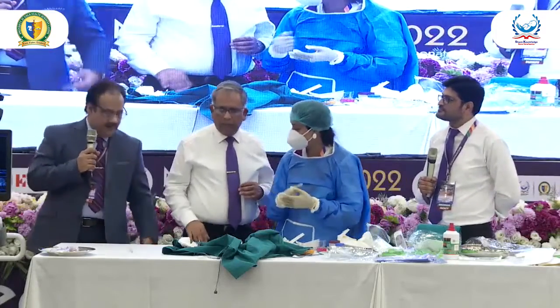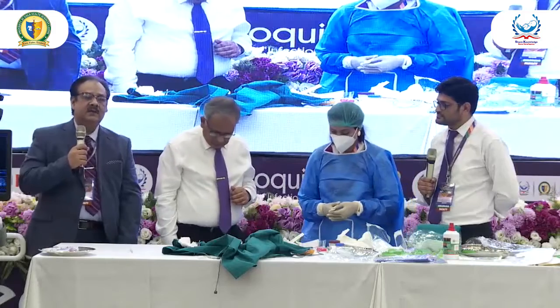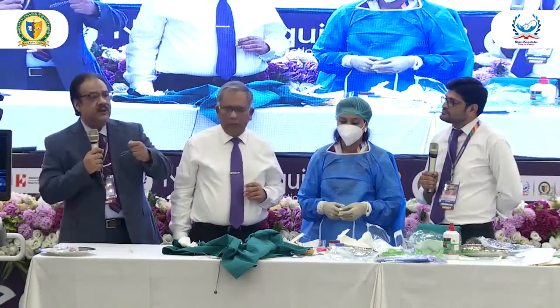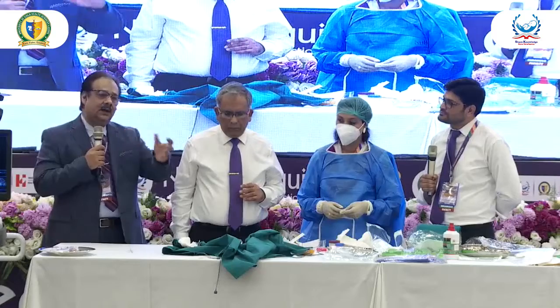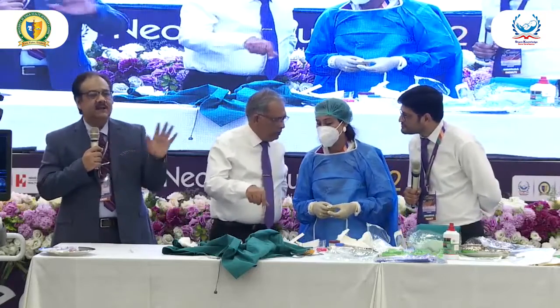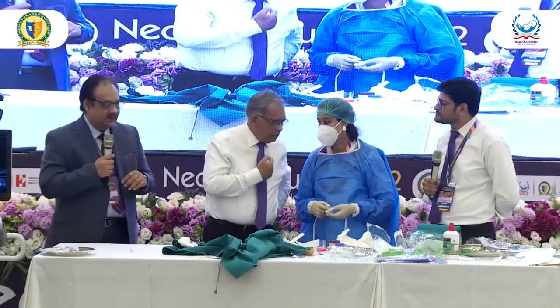Any position, let's say you put in the saphenous, it goes up to the higher part of the saphenous, and for some reason you cannot proceed, but do not try to remove it or pull it. If it is flushing very nicely, just leave it alone. It will last at least 2-3 weeks.